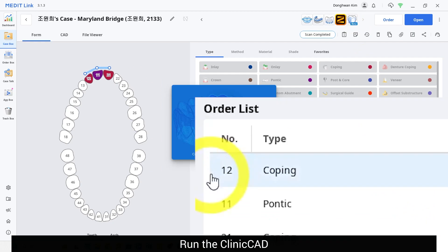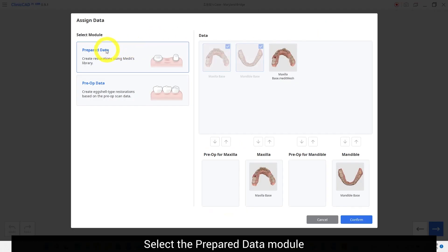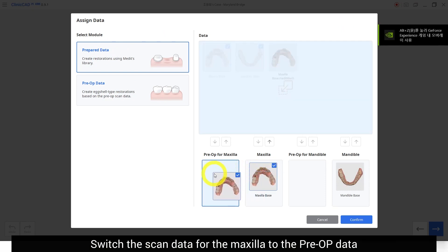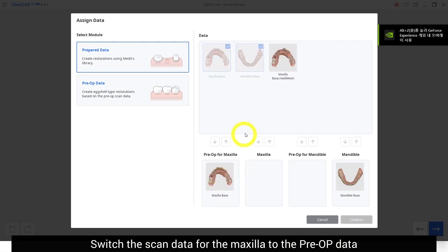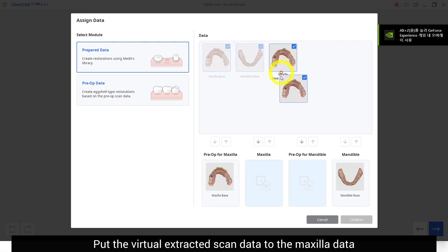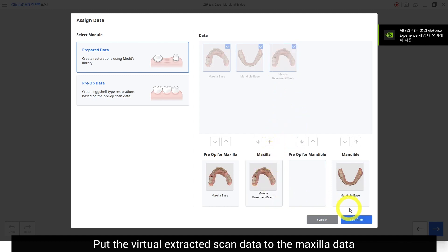Launch the ClinicCAD software and select the prepared data module. Switch the scan data for the maxilla to the pre-op data, then put the virtual extracted scan data to the maxilla data.